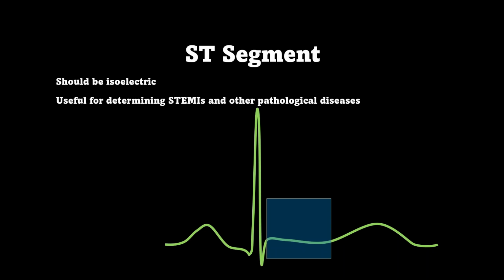And normally I would talk about the T wave, but the T wave is very complex with the various morphologies that it can have. If you have a narrow peaked T wave, you can have something called hyperkalemia. If it's more of a frowny, wide-based, or symmetrical T wave, that can indicate some kind of ischemia, but this is a topic for a different type of video.